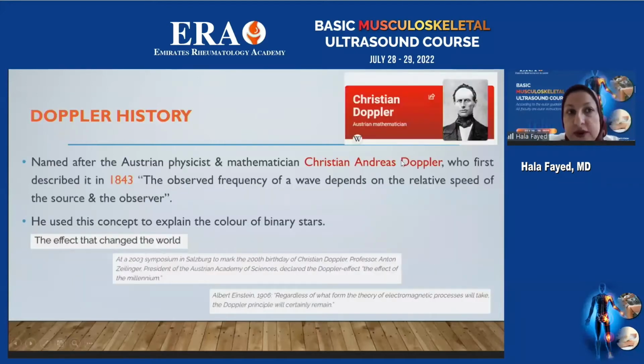So what is the history of Doppler? Actually, it was as early as 1843. It was named after the Austrian physicist and mathematician Christian Andreas Doppler, who described it for light, and he stated that the observed frequency of a wave depends on the relative speed of the source and the observer. This theory was a really important theory, and many things were based on it afterwards.